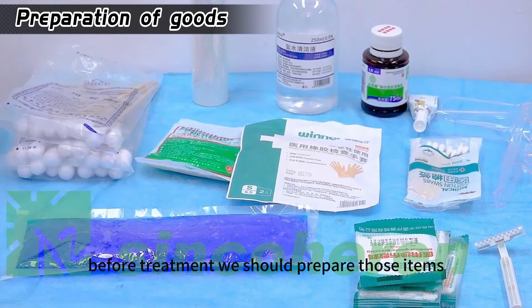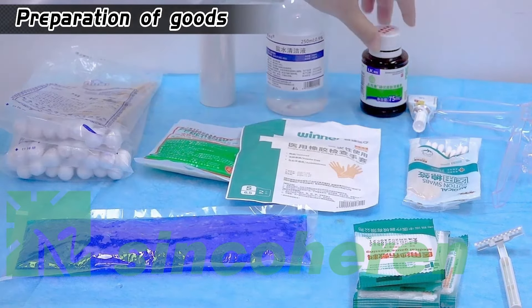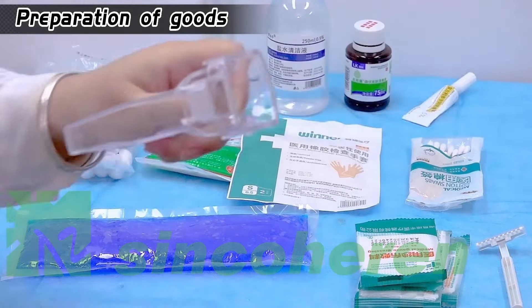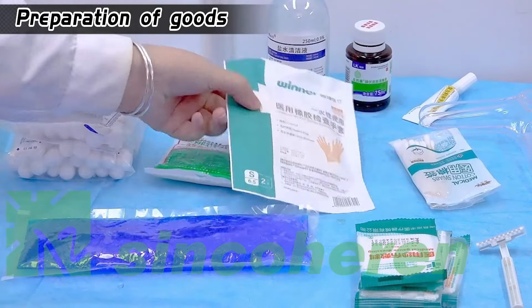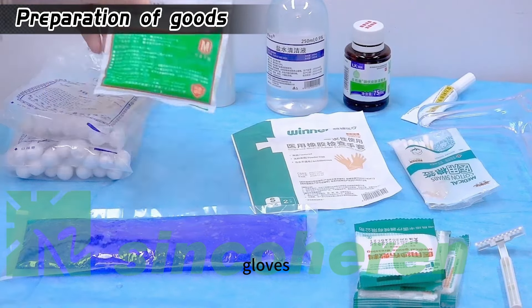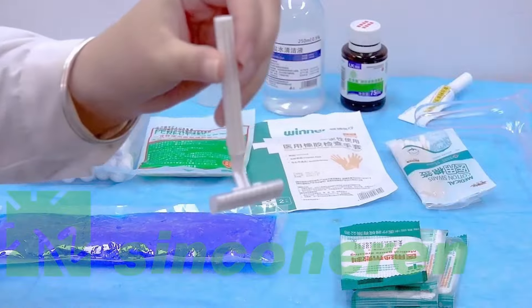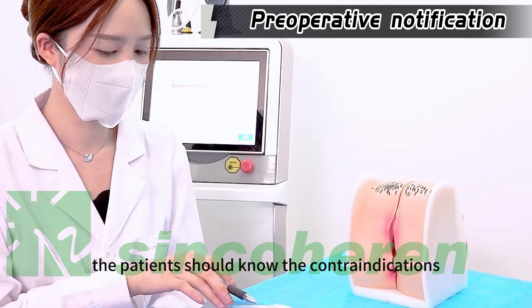Before treatment, we should prepare the following items: plastic wrap, sterile saline, non-alcoholic povidone-iodine, anesthesia, vaginal speculum, small cotton swabs, sterile gloves, large cotton swabs, ice bag, sterile gauze, and a razor blade.